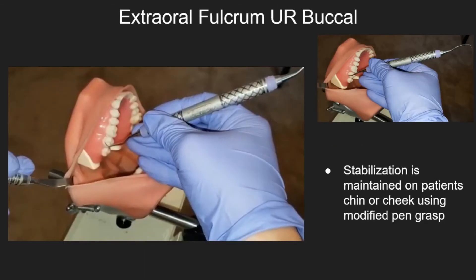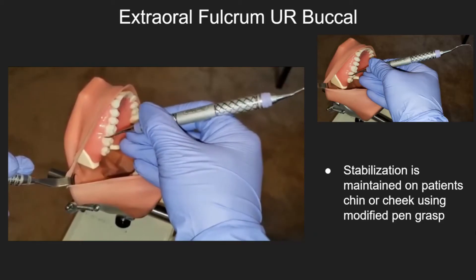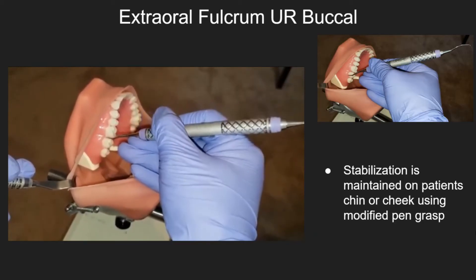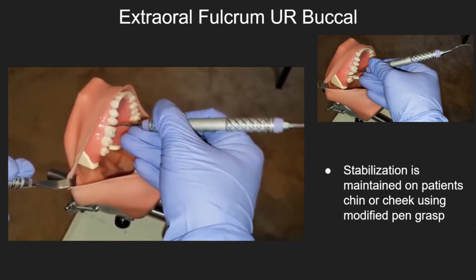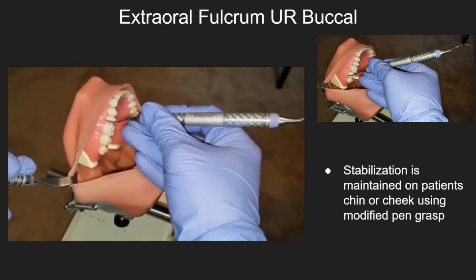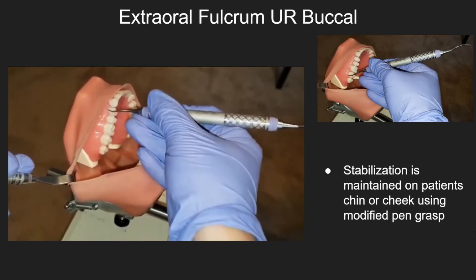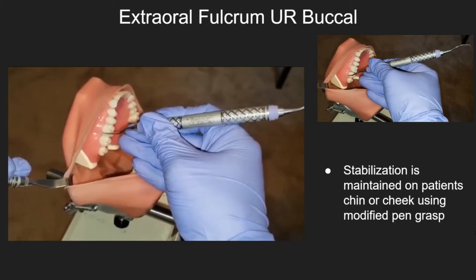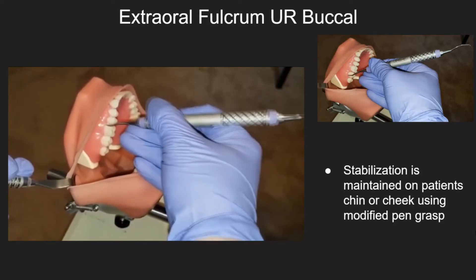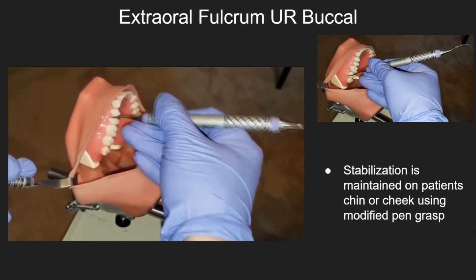Advanced Fulcrums. Extraoral fulcrum — upper right buccal. When using an extraoral fulcrum, stabilization is maintained on the patient's chin or cheek using the modified pen grasp. Make sure that you hold the instrument handle farther away from the working end while maintaining the modified pen grasp. An extraoral fulcrum aids to enhance access for hard-to-reach areas but can also pose a risk to either the patient or the operator if proper stability is not established.